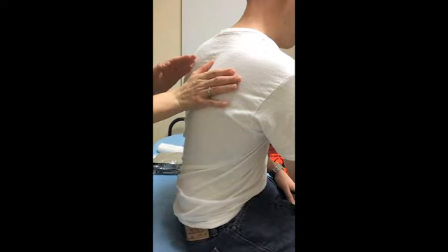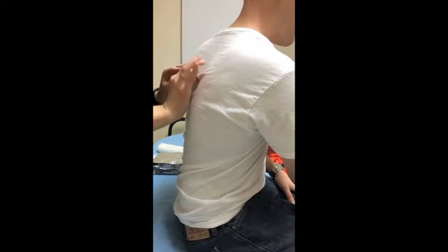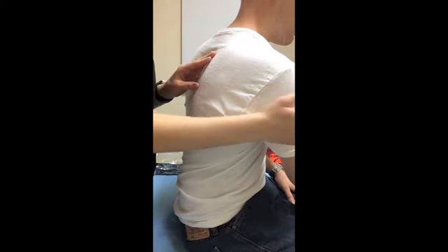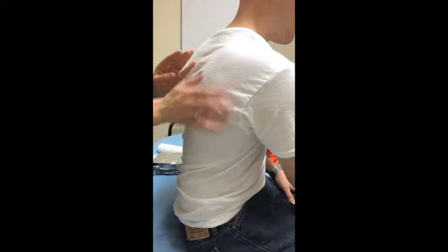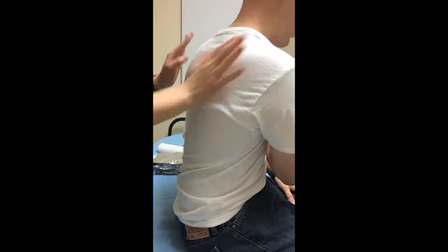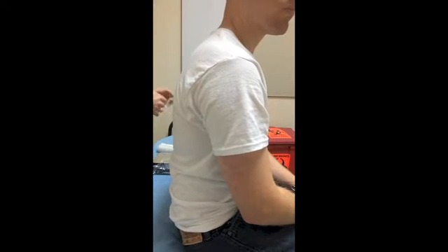Most of the time, if you're applying a splint on a patient with a humeral coaptation, you're going to want them to have a gown on with their arm out of the gown. It does make it very hard for them to get dressed later on, but to be able to start with nothing on is the best. For training purposes, our patient is going to leave their t-shirt on, and we're just going to talk about padding and measuring.